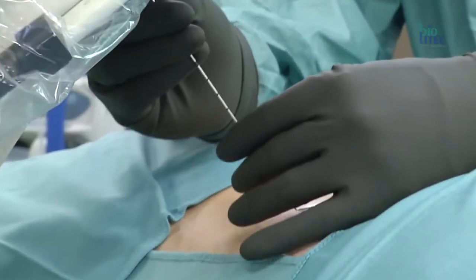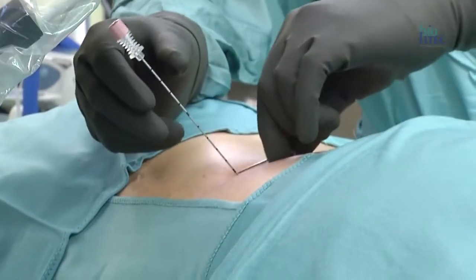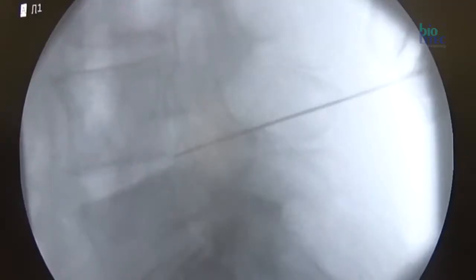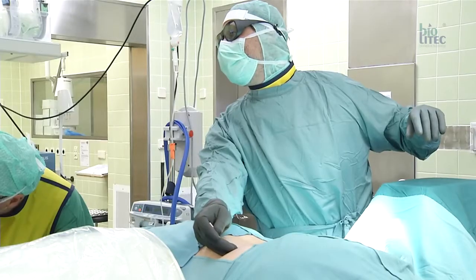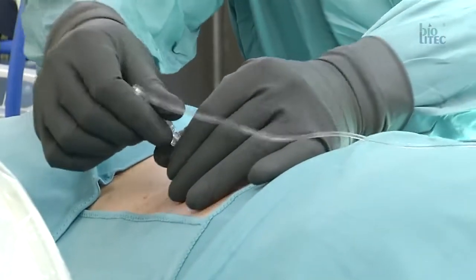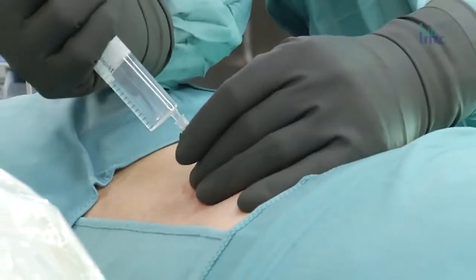The nucleotomy at the lumbar spine is carried out with an 18g needle under fluoroscopic guidance after local anaesthesia. The right position of the tip is the dorsal one-third of the disc. It is important to maintain a parallel alignment of the needle between the vertebral bodies. The right position should be controlled in AP and lateral view. A discography with contrast medium provides further information about the condition of the disc. A memory pain test, which is a provocative test due to an intradiscal pressure increase, is also a good diagnostic tool and is routinely performed before treatment.